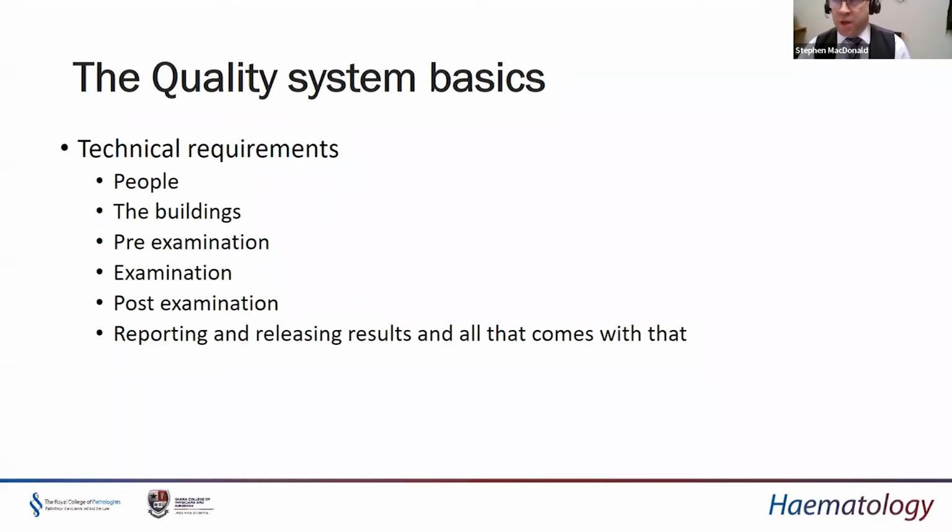We have the post-examination procedures where we are sending results to the people that have requested those results, because fundamentally the workflow is generally patient is presented to a clinician, who determines what tests are most important based on the clinical presentation of that patient, and then as a result they need to know what the results of those tests are, otherwise they can't instigate clinical interventions or decide on a different diagnostic pathway if required.